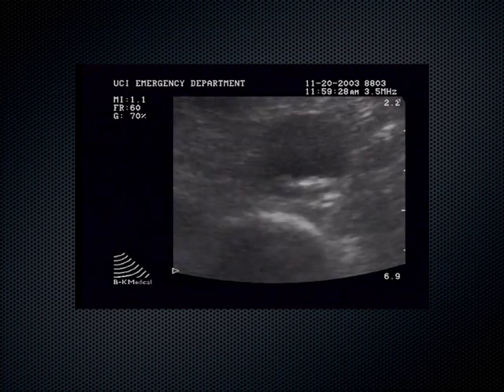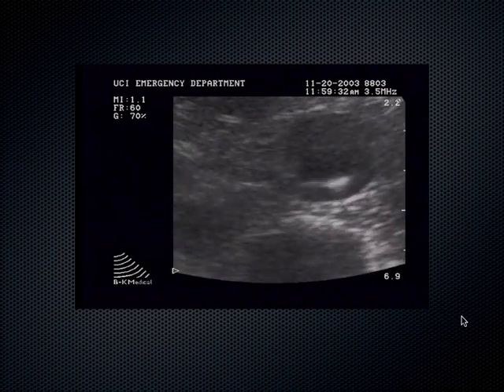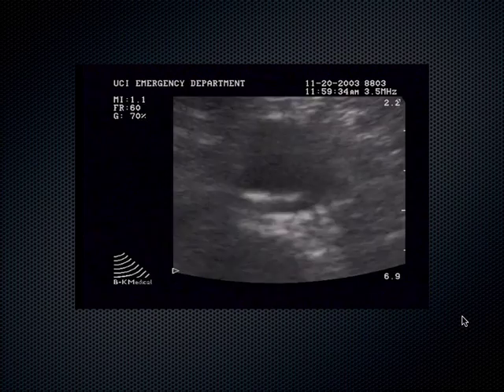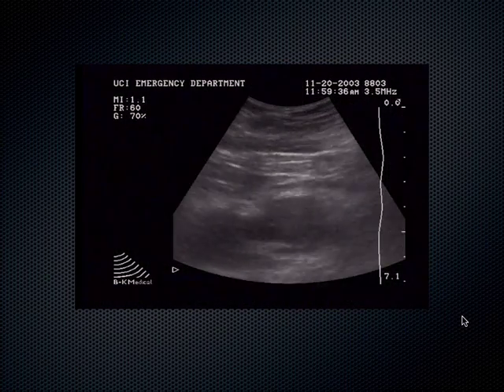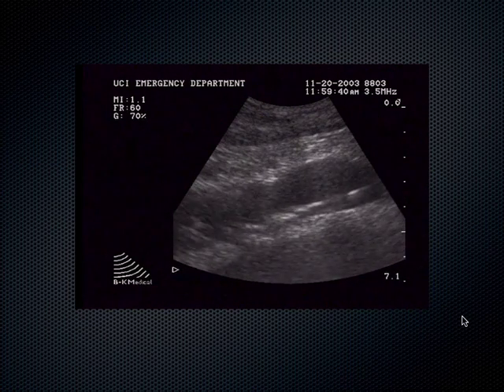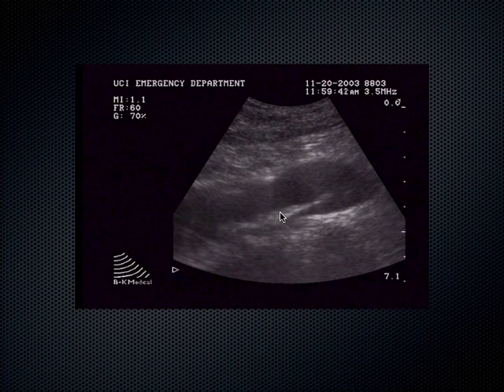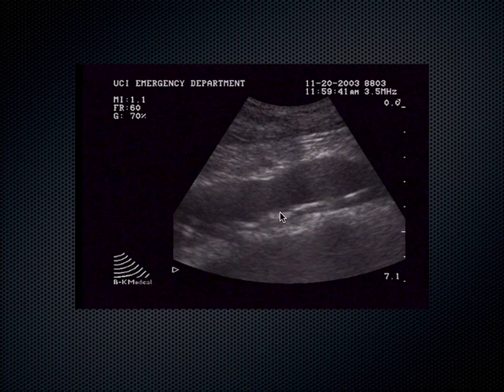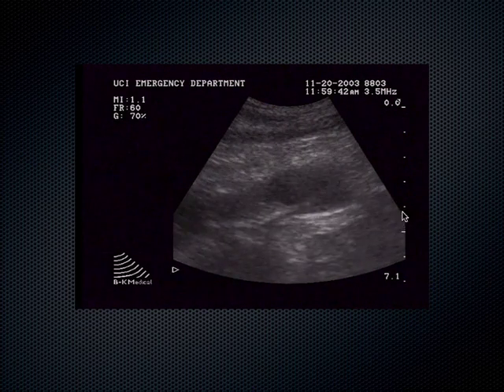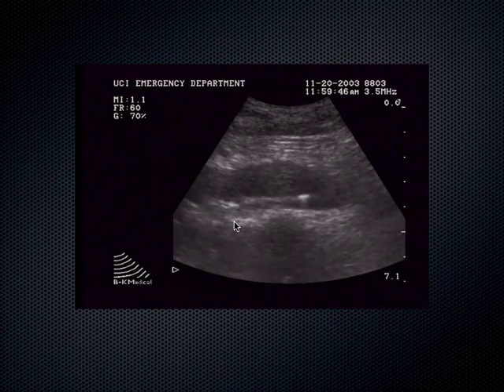What's this diagnosis? Here's the spine shadow right here. We've got it zoomed. Our depth is pretty decreased. What do you think's going on here? We're in the sagittal plane now. Pay close attention to this line right here. Why is it fluttering? What is that? How would you describe this? It looks like a valve. It looks like a big valve. Now, arterial structures don't have valves. Only veins do. So what the heck is this?